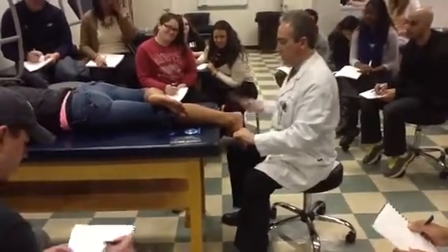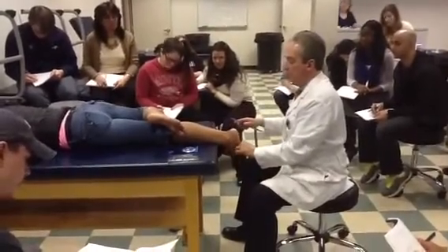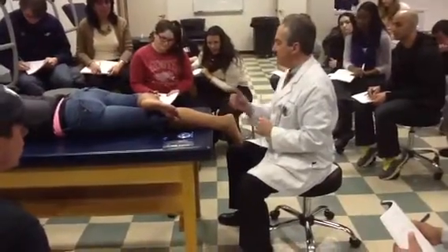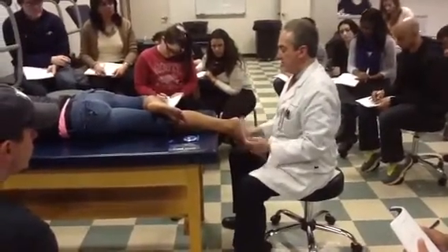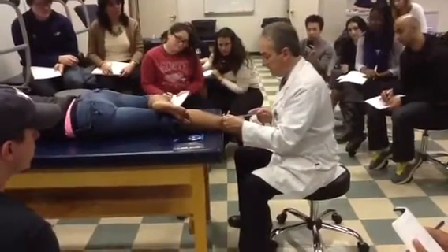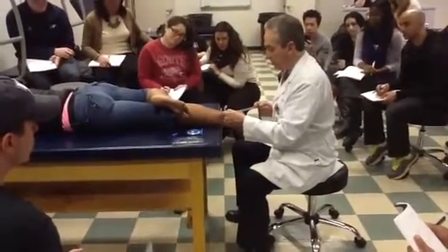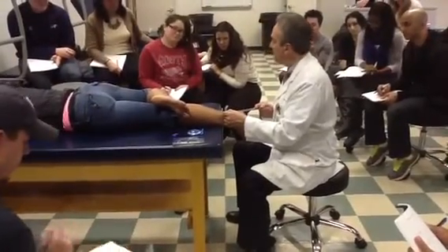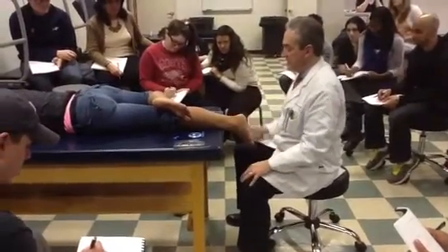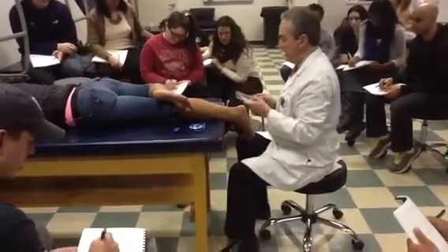Good. So it's real easy. Again, eversion, inversion. Now, another thing you can sneak in there is if you want to see just what the subtalar joint neutral position is, a lot of times when you leave the foot just dangling over the table like that, and you take your measuring tool, bisect the leg, bisect the calcaneus, it will actually show you what the neutral subtalar joint position is just sitting there. Sometimes, not all the time. So you can sneak that in there if you want. But it's very easy. It's easy to use the OED also.